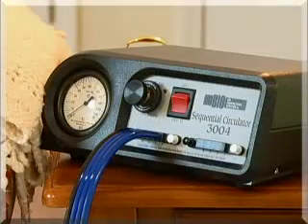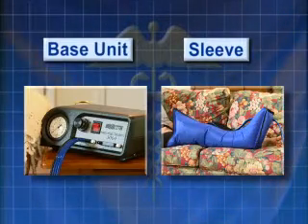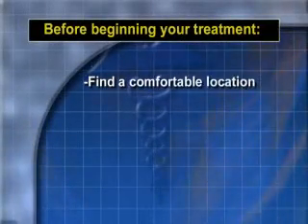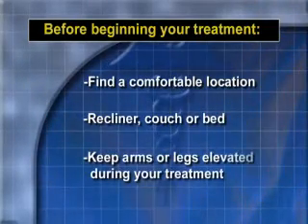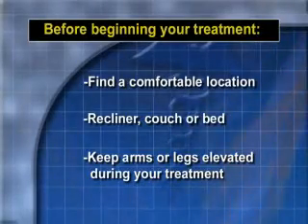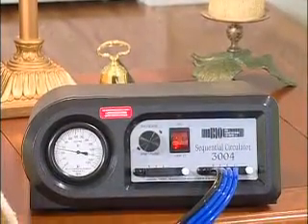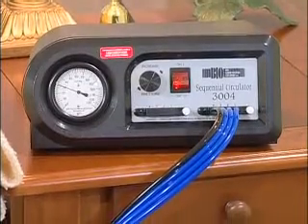The system you will be using consists of two components, the base unit or sequential circulator, and the arm or leg sleeve that your doctor has ordered. The first step in setting up your pump is to find a comfortable location for your treatment, such as a recliner, couch, or bed. It is important to keep arms or legs elevated during treatments. This will move the buildup of fluid more effectively. Plug in the base unit and place it on a flat surface nearby. In most cases, your dealer or provider will set up the equipment and give orientation as to its proper use according to your doctor's orders.